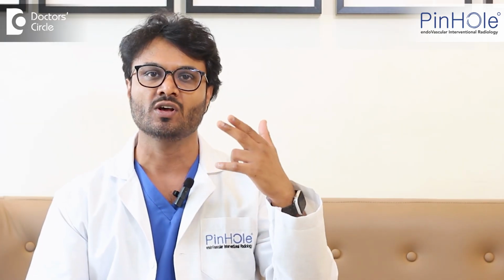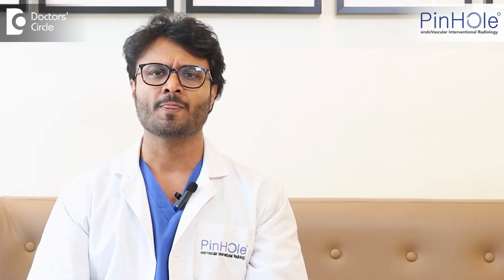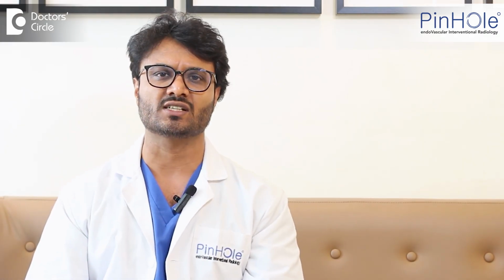You do not have to undergo repeated multiple biopsies. It's a predominantly pain-free procedure, and you'll have a bandage for 4 to 6 hours. You can shower the same day. You can get back to your routine the same day or the next day morning.